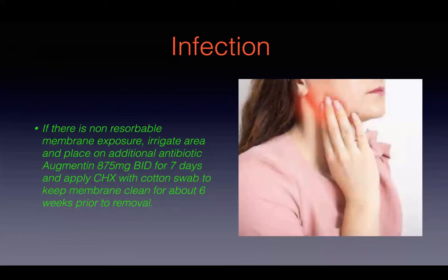Okay, we have Greg. Greg presented with mobile teeth 7, 9, and 10. He did not like to smile much. It would also hurt him when he chewed. He had been missing tooth number 8 for a while. And he didn't want ortho, and finances were limited. Here's an intraoral. So the plan here was to remove again teeth 7, 9, and 10.